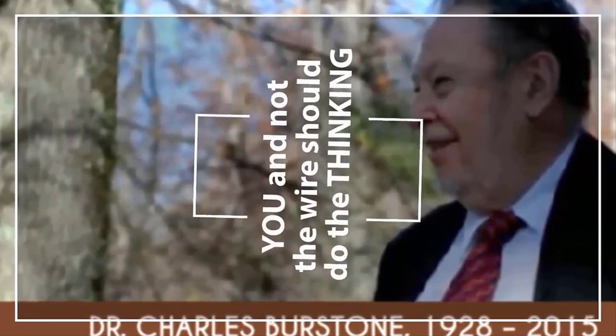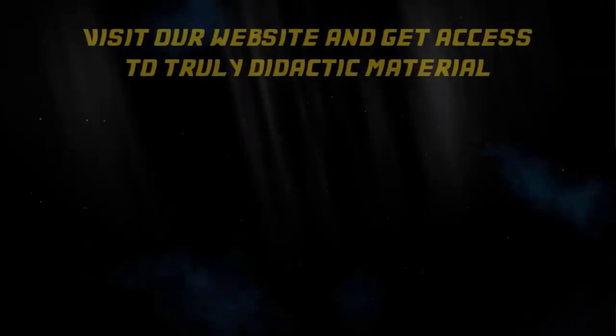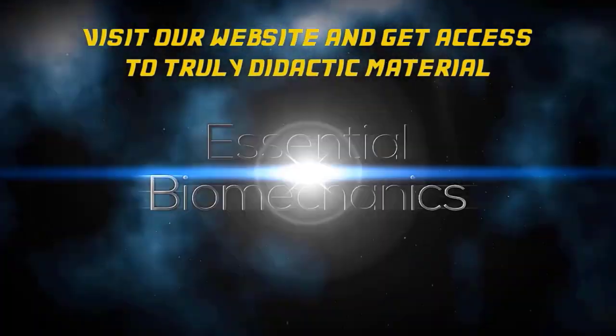If you want to apply a different force system corresponding to a different geometry, you will follow the same principle. By achieving the appropriate proportion of the geometrical relationships of the geometries, we can produce any force system corresponding to the 6 geometries. I hope you have enjoyed this video, and I hope to see you in our next orthodontic tip.